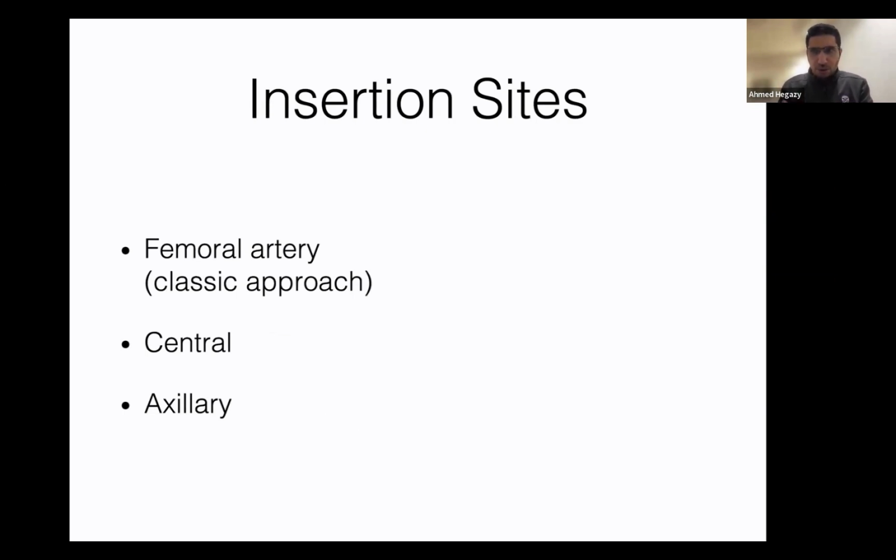However, sometimes in the OR, when you have somebody coming out with an open chest, sometimes we see surgeons who have put in a balloon pump centrally. And what do I mean by centrally? They've actually punctured the distal arch and the start of the descending aorta.